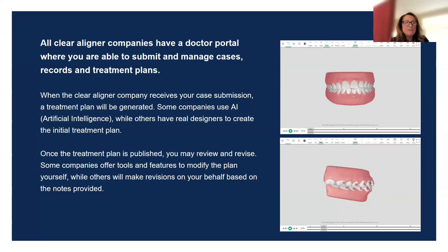So once you submit your case for your treatment plan, all clear aligner companies have that doctor portal, like I said, so you can submit and manage cases, submit your records and treatment plans, like if you are going to set this case up for restorative, for veneers, crowns, whatever, implants.